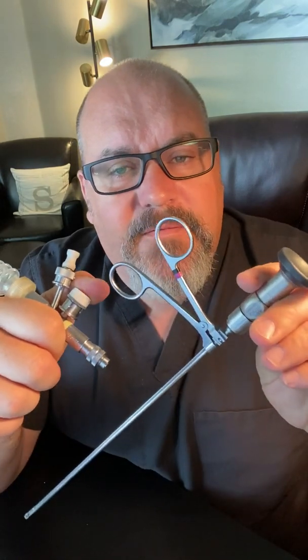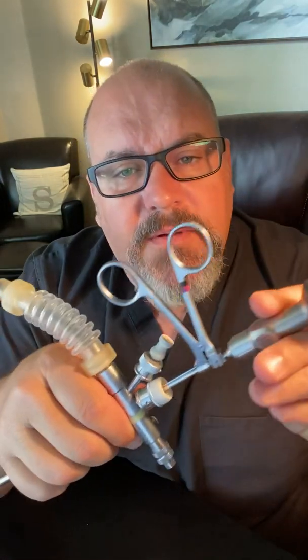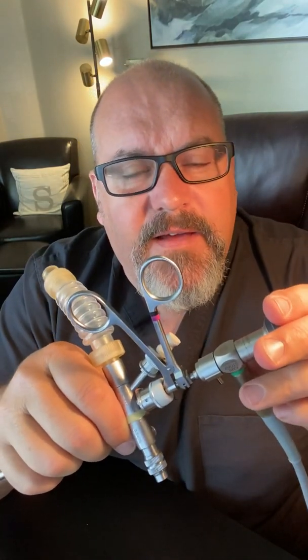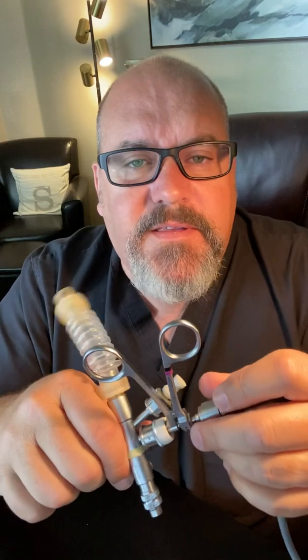At this point, once the surgeon has identified the foreign body, the surgeon pulls this whole thing out and plugs it with their thumb. You take the telescope guide, put it over the top, plug it up with your thumb, and move the camera from the rigid bronchoscopy telescope to the optical forcep. This simply goes into the rigid tube, down to the foreign body with the camera on, identifying the foreign body, grabbing it, and pulling the whole thing out of the patient — and you're done.